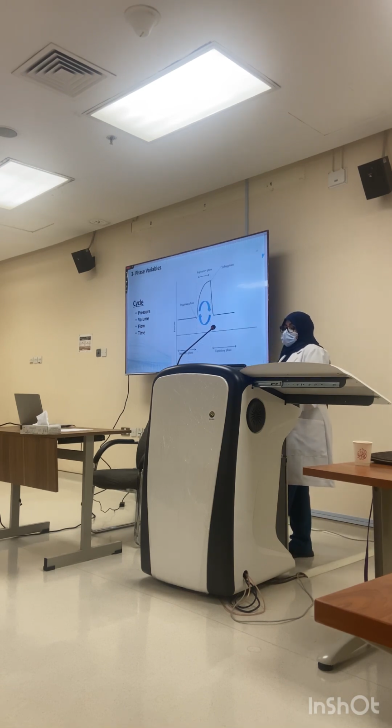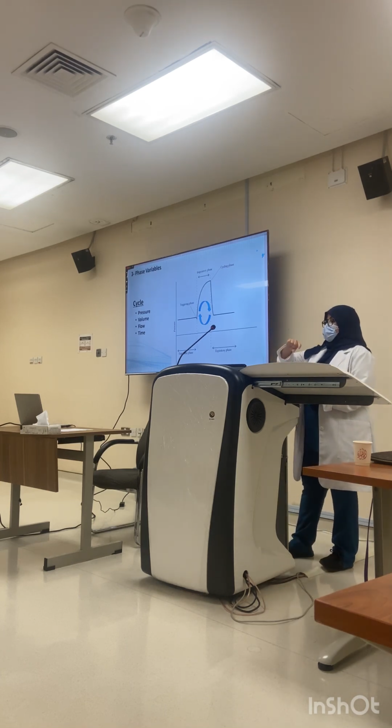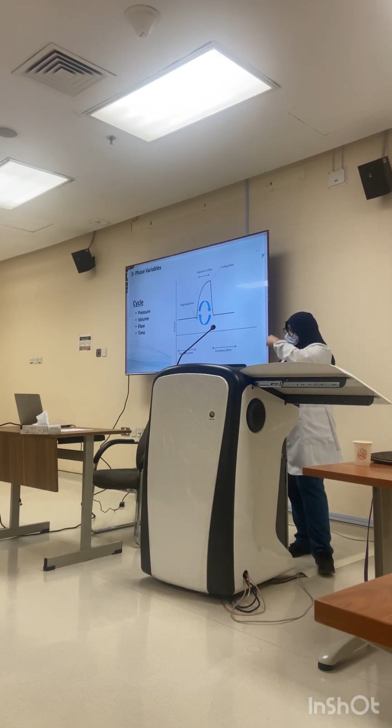The last phase variable we have is cycle. Cycle is basically the phase of inspiration, expiration. Inspiration is the first phase, expiration is the second phase. So what will the breath cycle be based on?